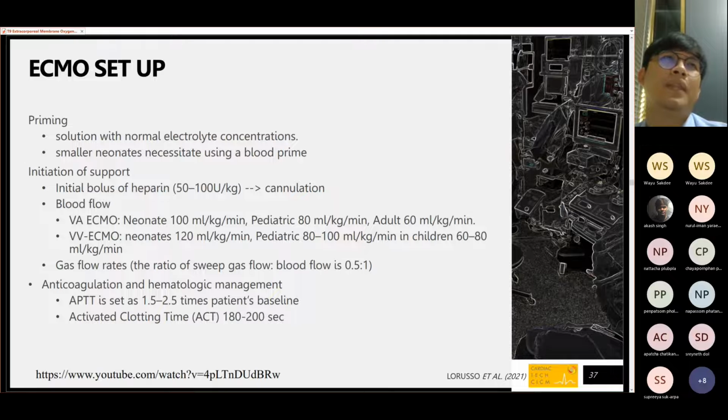So one of the problems is that we're not priming and deairing well enough. So when we put the ECMO into the patient, it's easy to introduce bubbles and cause air bubbles in the patient also.